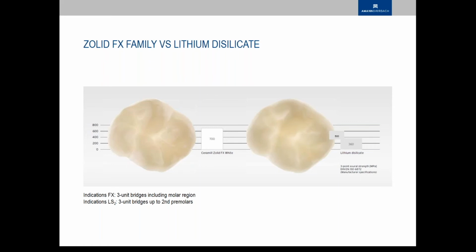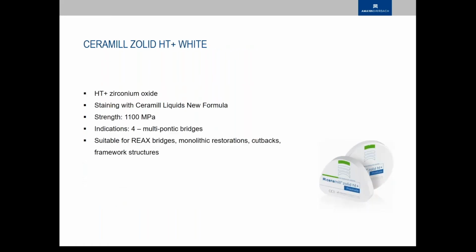That's a lot less. That's half what you would have to keep up with a lithium disilicate. You might be, depending on what rules you're following, keep 1.5 millimeter in your central occlusion. I think it might have been updated to 1 millimeter now to make the material more competitive. But yeah, it depends also where you're getting the lithium disilicate or lithium silicate from, I think.